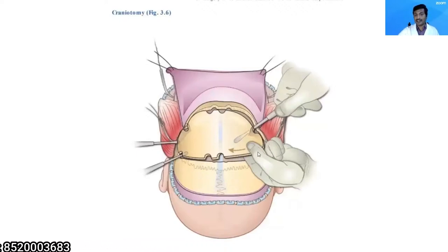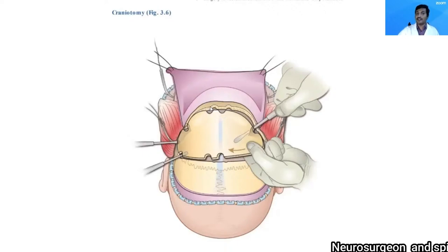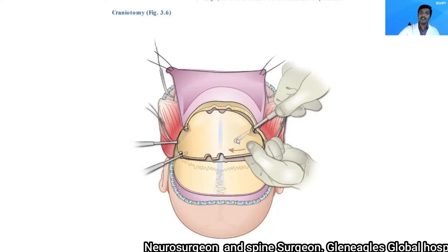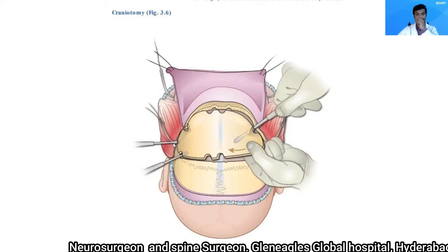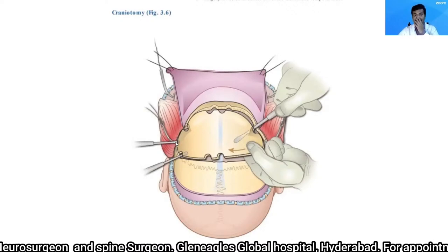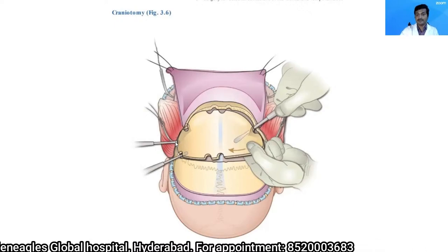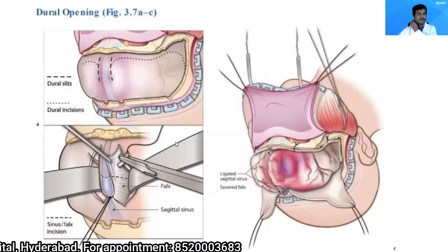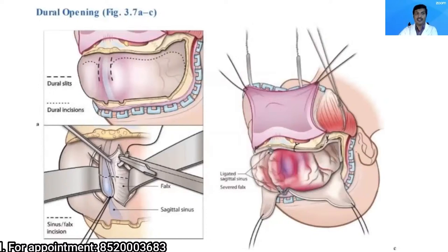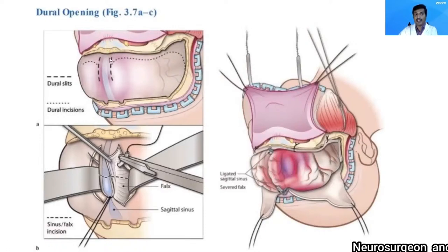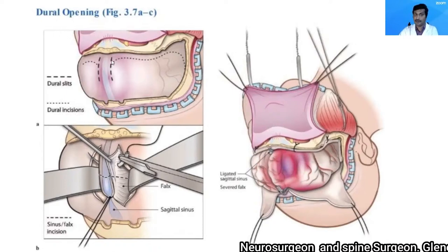Once you have connected the burr holes with the craniotome and connected the two paramedian burr holes, reflect the bone flap back. At this point, if you have opened the frontal sinus, I prefer to place a small flap of galea over it — that is, I will exenterate the sinus at this point.